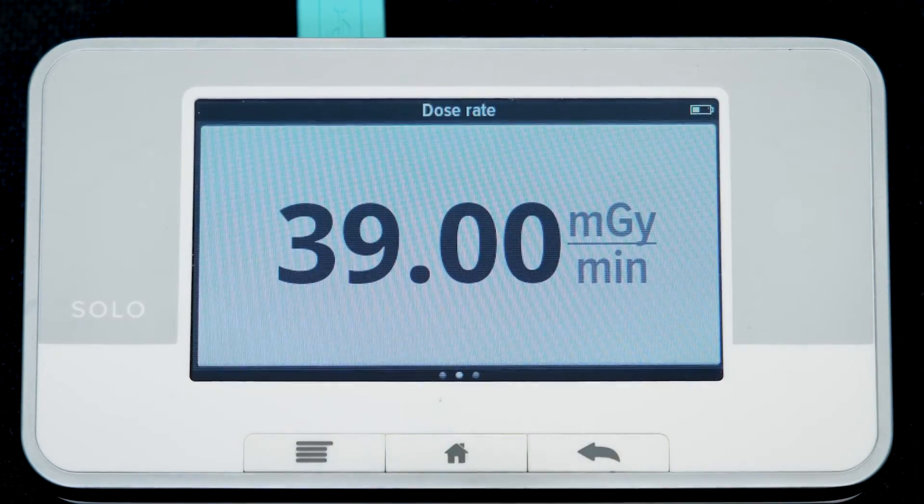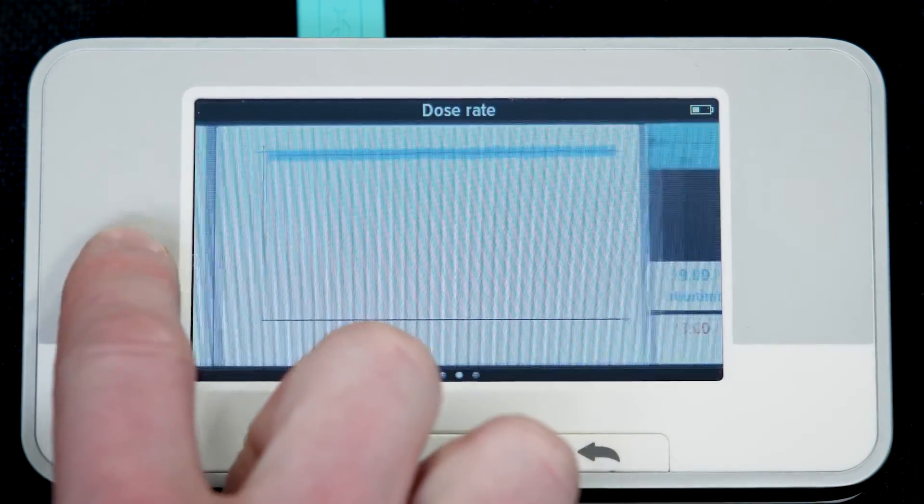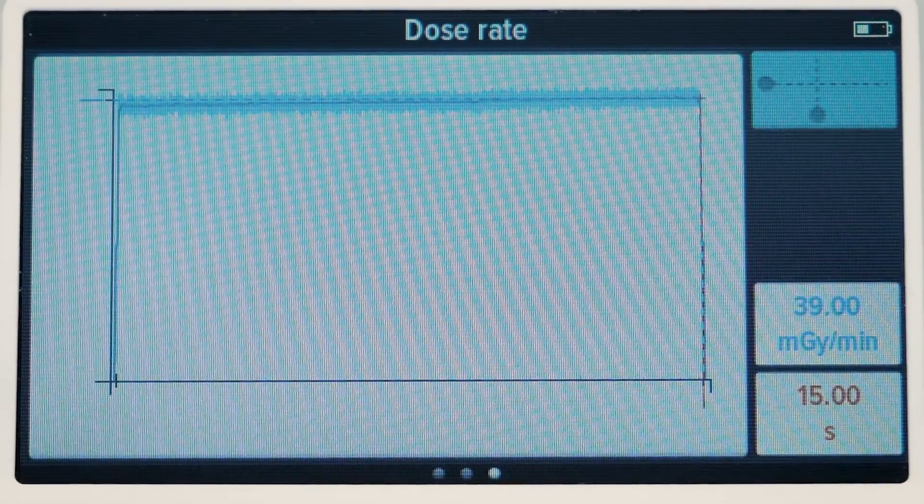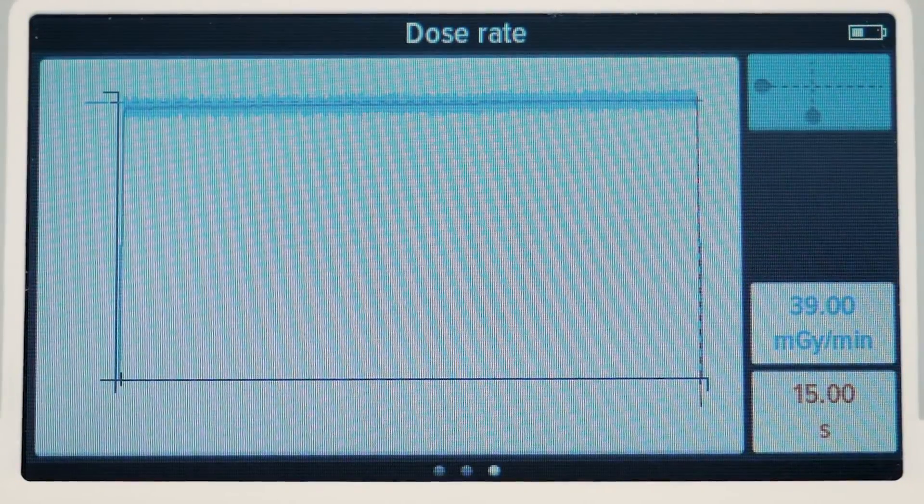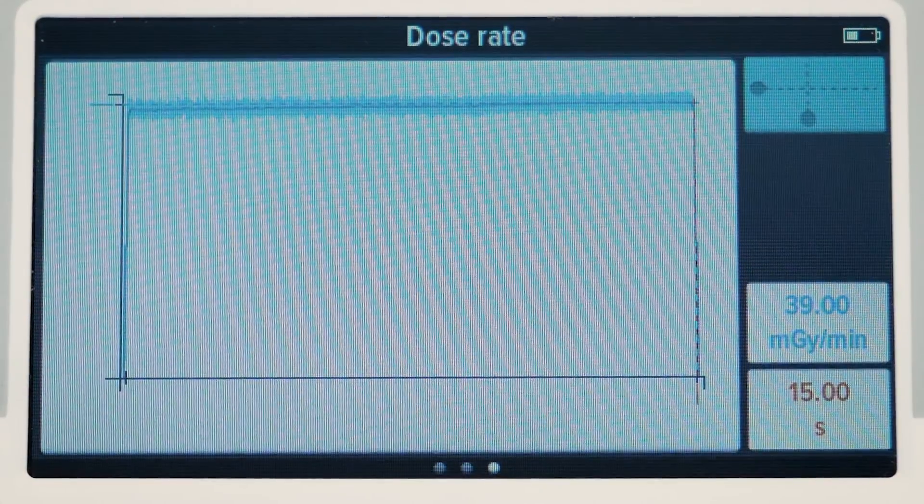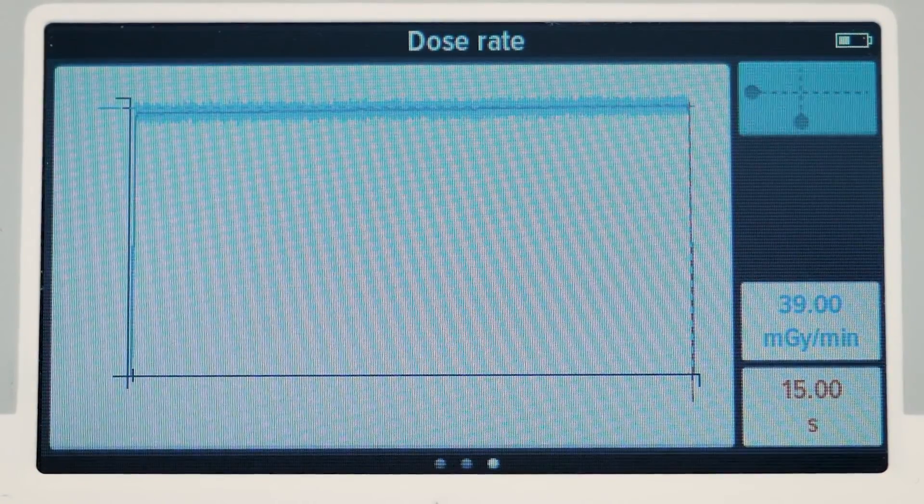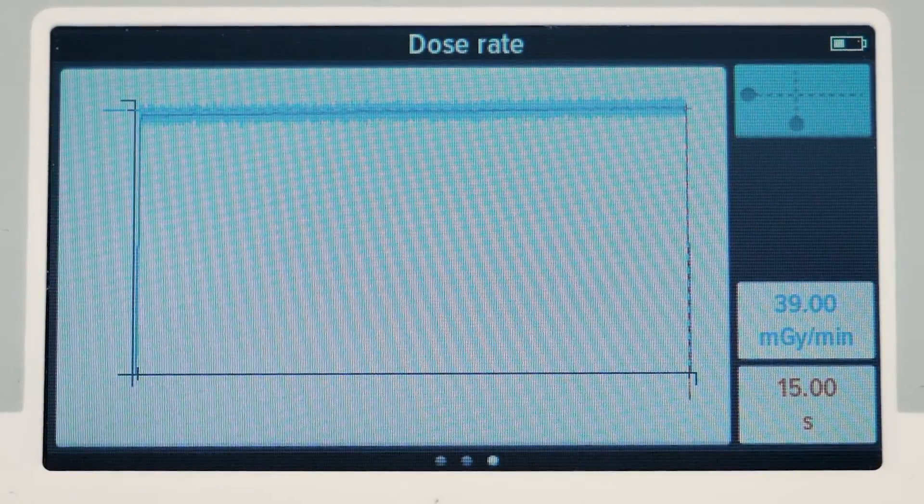If we take a closer look at the waveform, it now looks flat, which is good. A stable dose rate means that the sensor is correctly positioned in the center of the X-ray beam and it will measure the maximum dose. We can now trust our readings from the instrument.